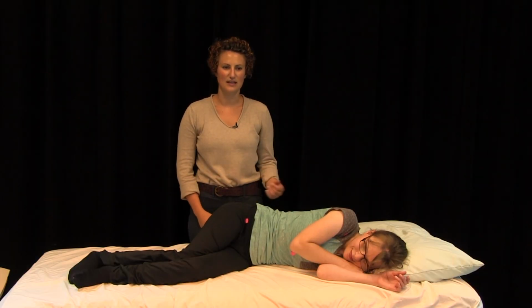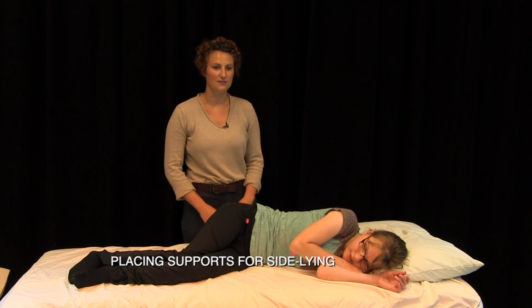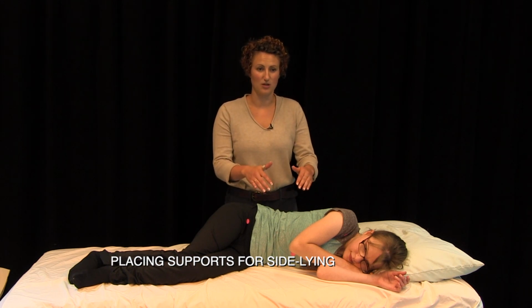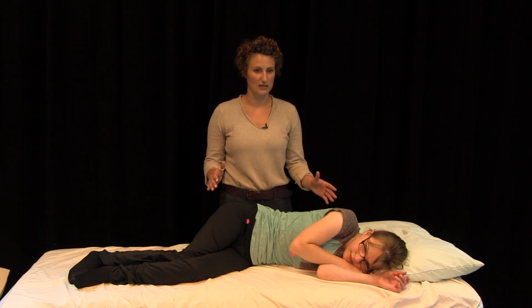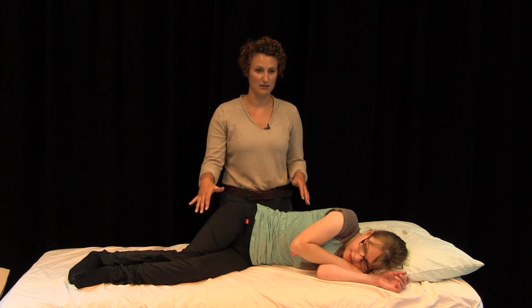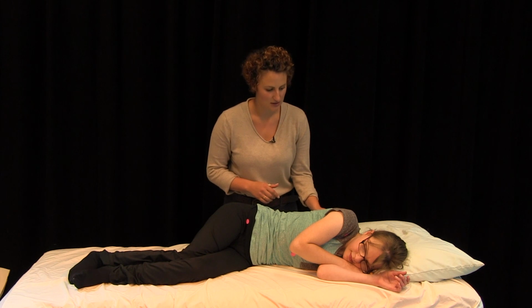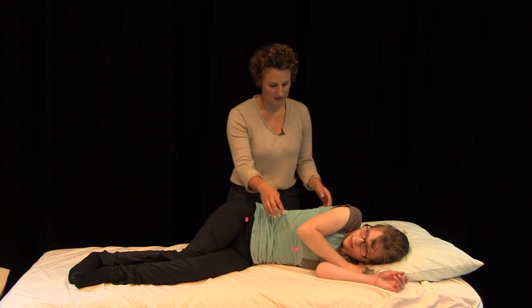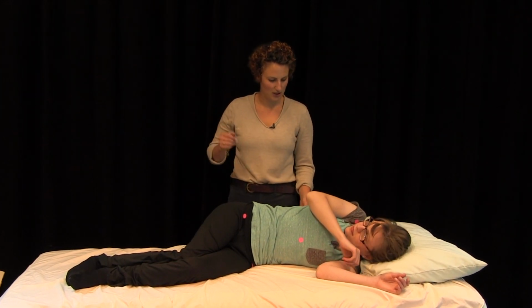If the user needs to lie on their side, preventing body rotation is the priority. If the user's trunk is rotated even slightly, gravity will increase the rotation over time. So notice where the user's body is prone to rotate. This will be impacted by the weight of the top arm and top leg. The chest may be rotated down towards the support surface or up towards the ceiling. And Abby will show that here a little. Yep, right now she's kind of rotated down, and now we'll show a little rotation up.